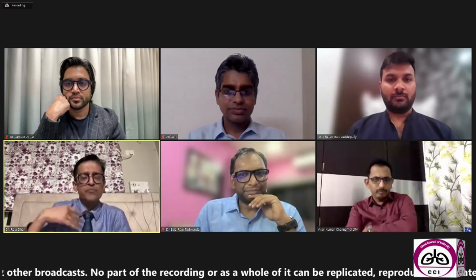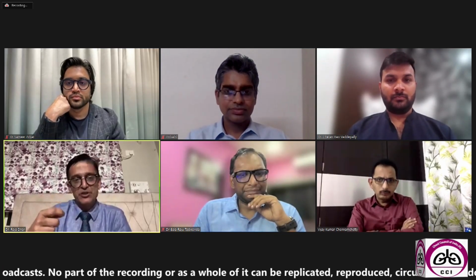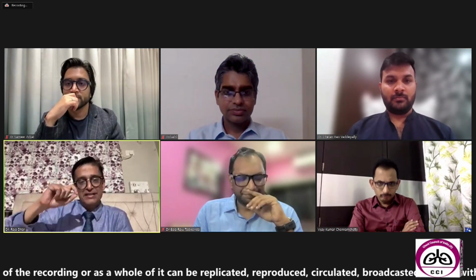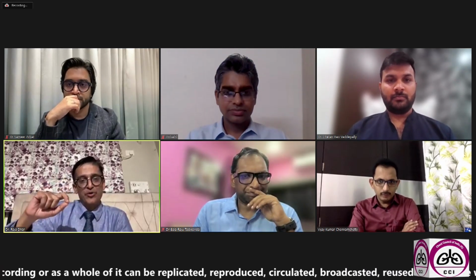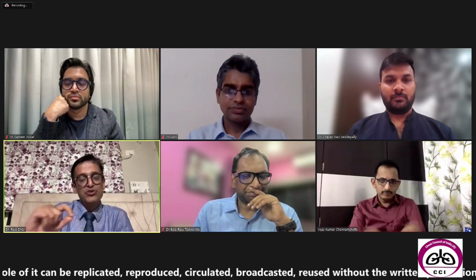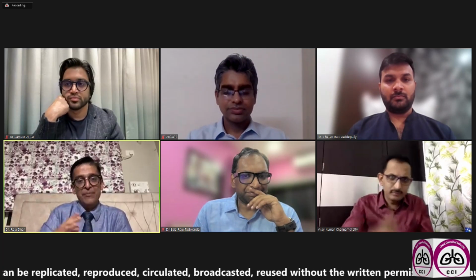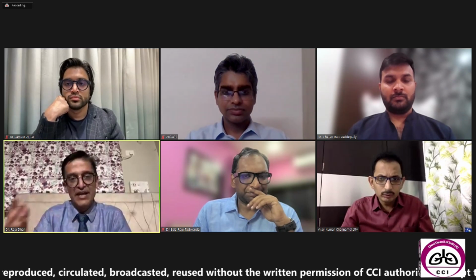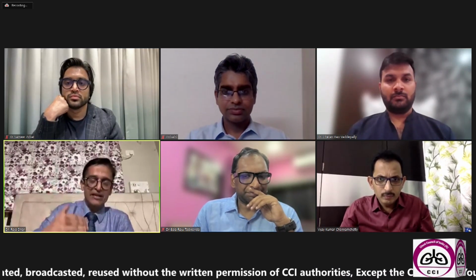No, absolutely, Vijay. In my understanding, I'll tell you my experience with the 1.1. I actually find the 1.1 quite floppy. It doesn't have the stiffness of the 1.9 or the 2.4. And I find it a bit of a challenge to use it to do transbronchial cryobiopsy. There's a head-to-head trial, as you know, between a 1.9 and a 1.1, and it says, like you said, Vijay, that the yield is apparently similar. But maybe it's my learning curve that when I'm using the 1.1, the yield of tissue that I get is far lesser as compared to what I get out of a 1.9.